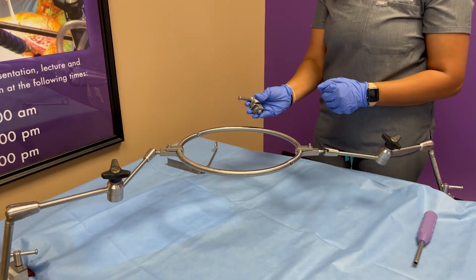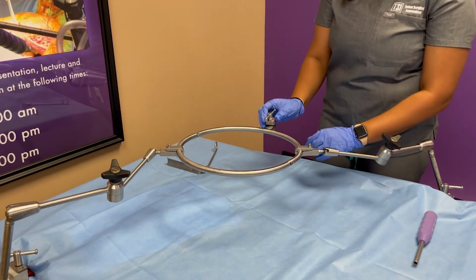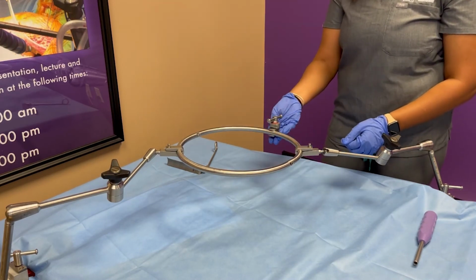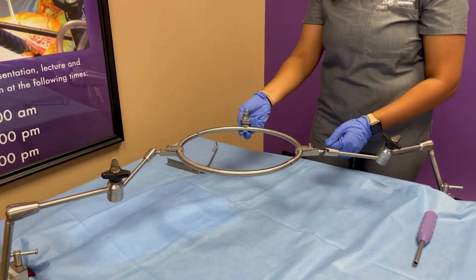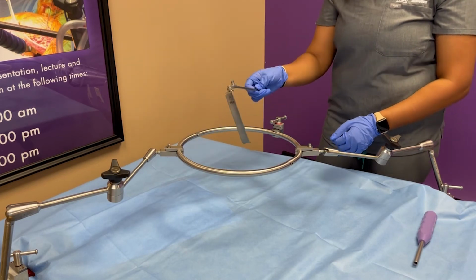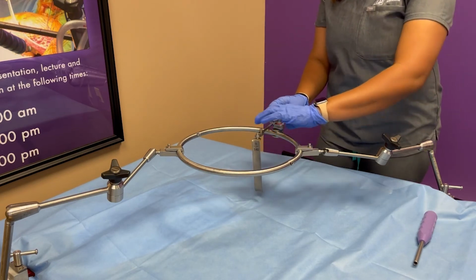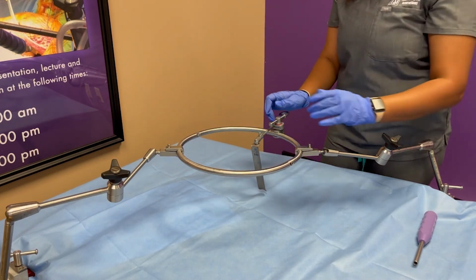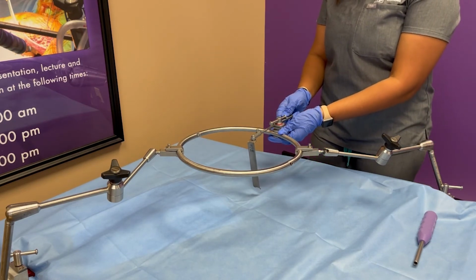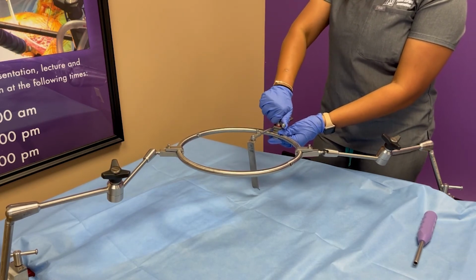Next, we're going to attach our ring clamps to the Phantom AL ring. In order to do this, you're just going to position and push till you hear a click to lock into place. These ring clamps can be positioned anywhere on the ring for more customized retraction, and you will position your blade to blade holder assembly where you need in the incision, retract, and then click on to your ring clamps. Once everything has been fixated into the place that you would like, you will then tighten down on the ring clamp to secure it.